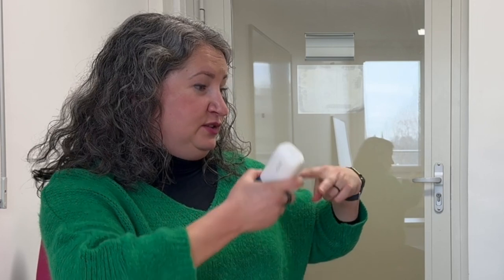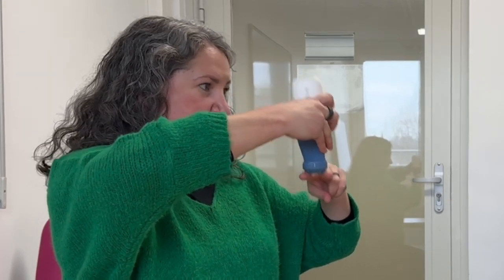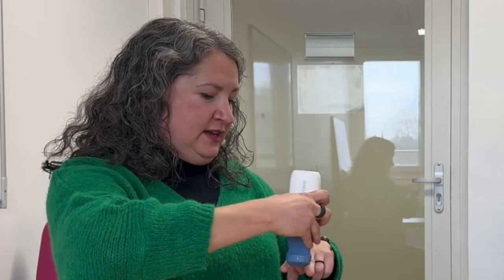So, brief interlude. I'm going to show what we're talking about with an actual device. People will talk about oblique or straight, but here we're talking about the rib axis itself. And you're going for the rib short axis, with the bat sign, bat side, no wings.